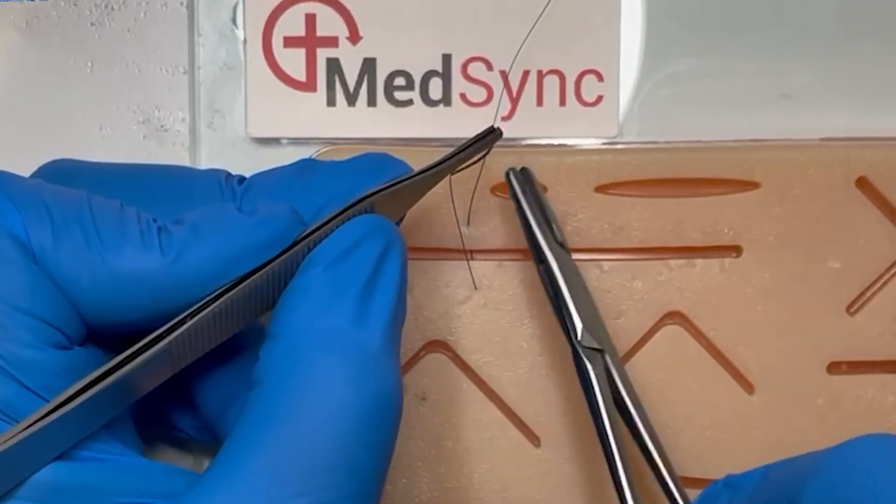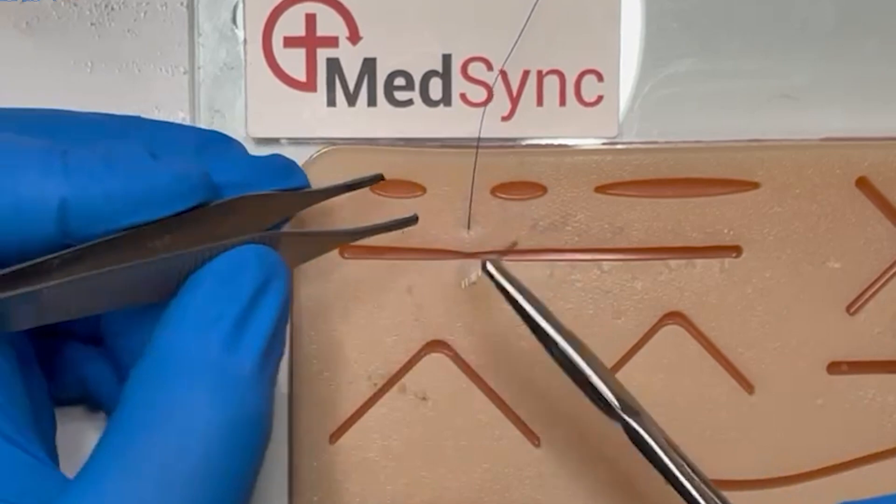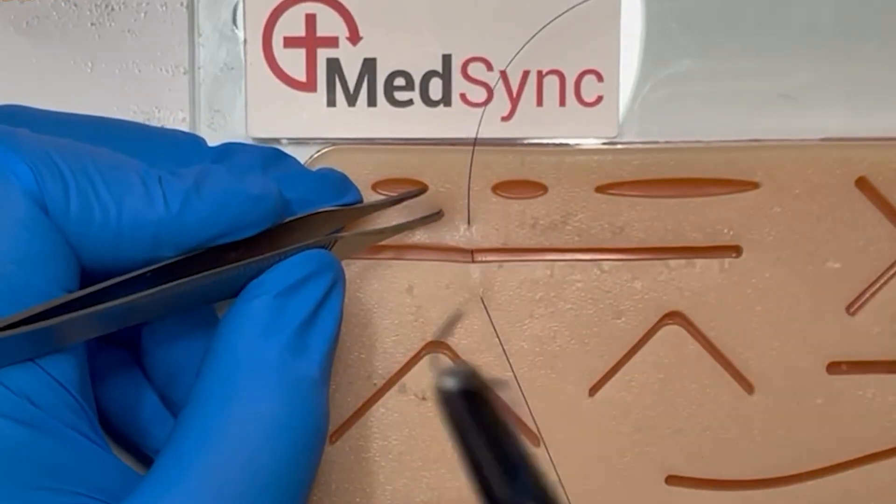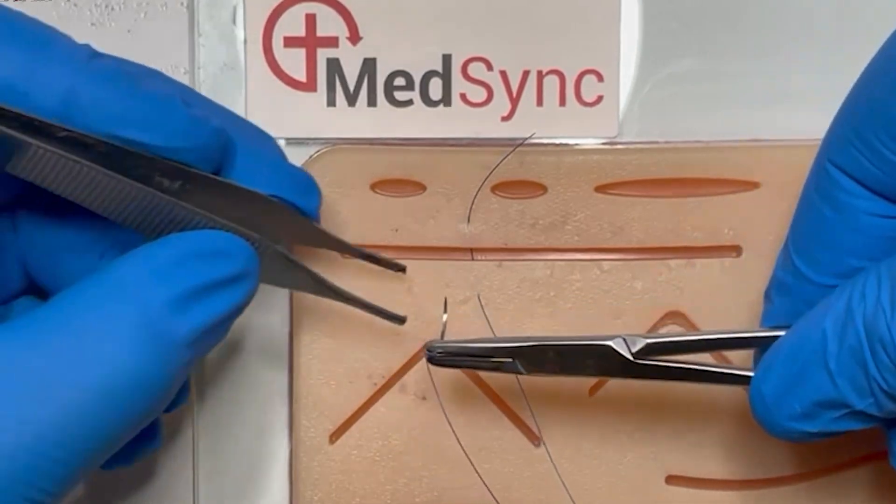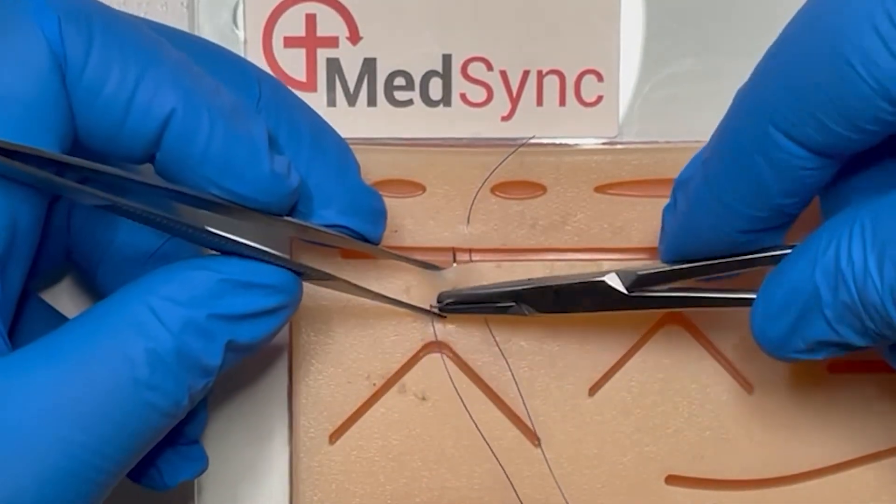This is followed by wrist extension, turning the needle point and allowing you to mount the body point away from you. This will allow you to seamlessly stitch in the opposite direction to which you started.